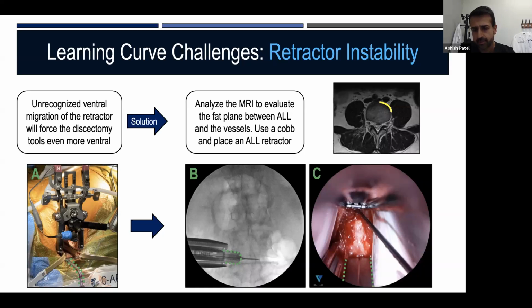There's screw shims that are available that go into the cranial caudal blade currently. And what's nice about that is it does provide some stability of the retractor to the spine, but it doesn't prevent posterior blade deflection ventrally. And so you have to answer that issue. So in addition to the pistoning, you really want to prevent the posterior blade from migrating ventrally. So I haven't done the double arm. I've found probably a way, maybe because of the shim itself, to find my method to gain that stability, but I've seen a lot of people use the double arm.